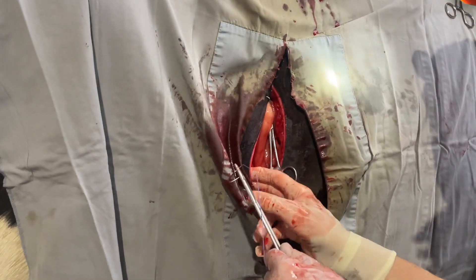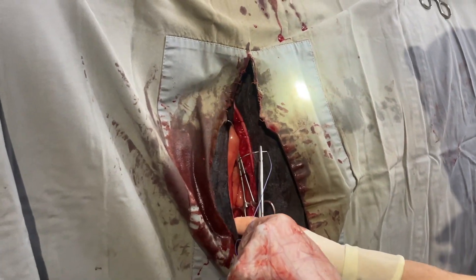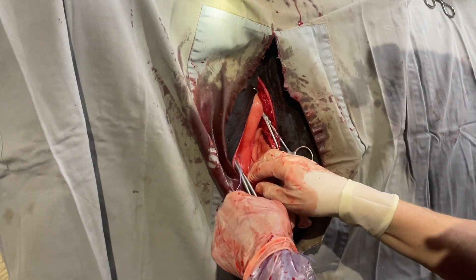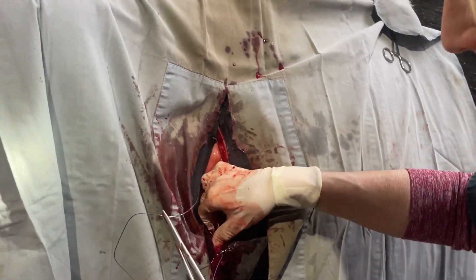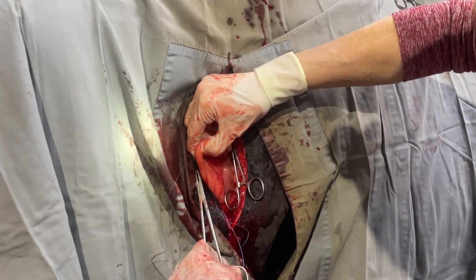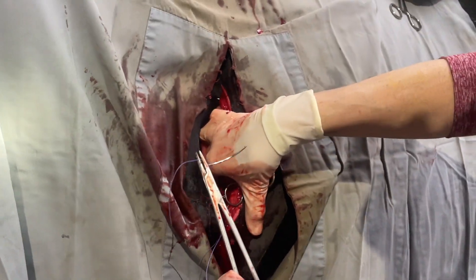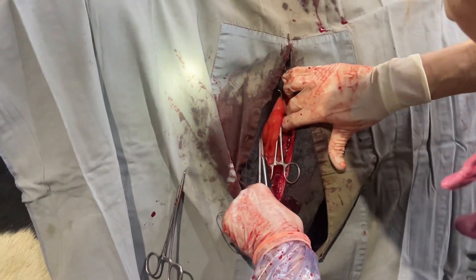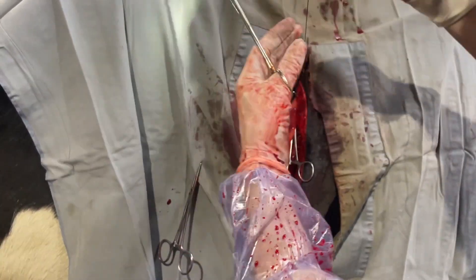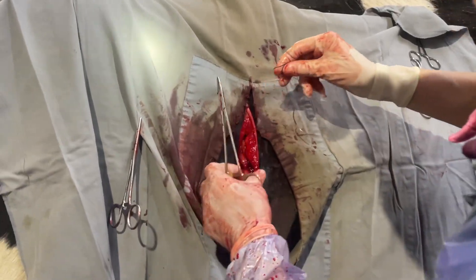So we're starting to suture her up. How many different layers of suture do you put in her? We'll put two in the muscle layers and then one in the skin — three altogether. This very inner layer is hard to block, so that's what she's feeling a little bit. Hard to keep them from feeling a little of that sensation. We'll take some of the omentum, a little bit of the pylorus, which is attached to the abomasum. What she's feeling is this inner lining of the abdomen that doesn't respond to the lidocaine. If she was very uncomfortable, she would be telling us in a different way.